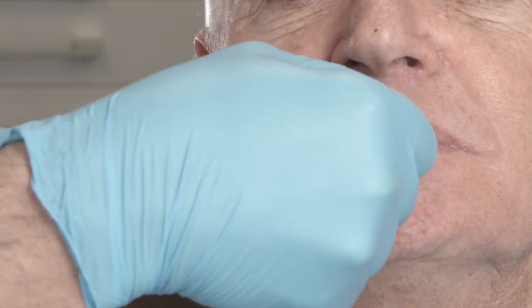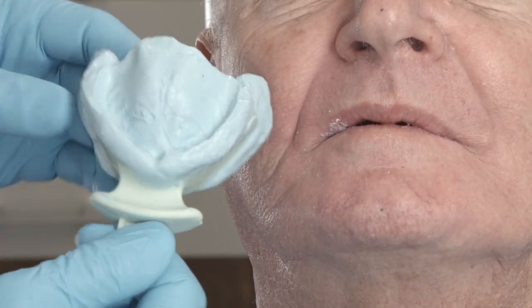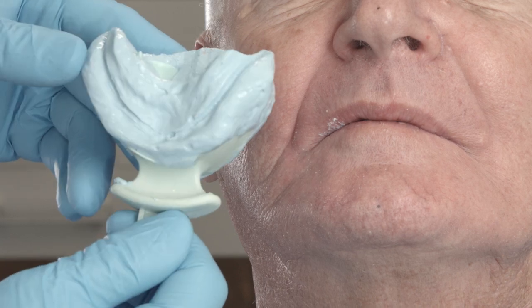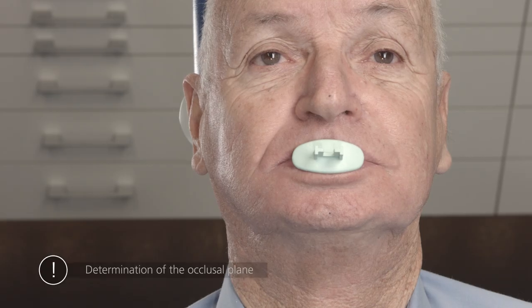By using the centric tray, you do not need to take complete impressions of the jaws. Simply make sure that adequately large corresponding surfaces are available on the impressions so that the software can allocate the impressions accordingly.